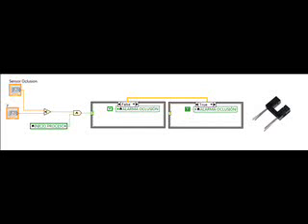The way the program activates the alarm is by setting a threshold for each sensor. If the sensor's output passes the threshold, it means that it is sensing air and no solution, which means that there are air bubbles or there is no solution during the infusion process.